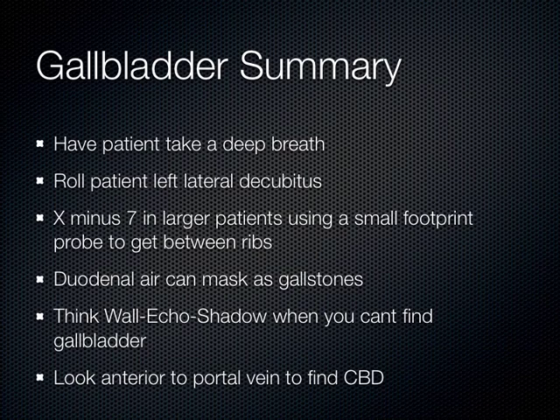Respire profundo. And that's the other thing. You're going to learn a lot of medical Spanish from me as we go through this ultrasound stuff. I'm not just about ultrasound, I'm also about medical Spanish and the way not to pronounce it.